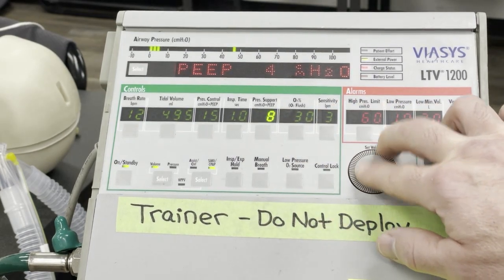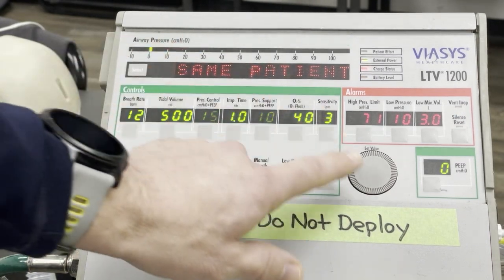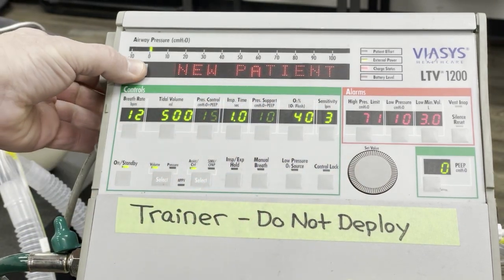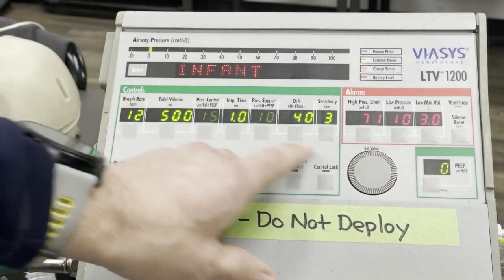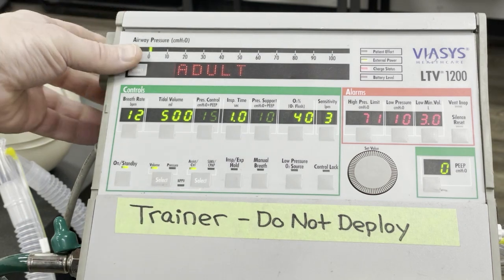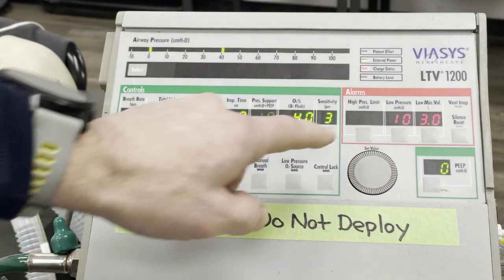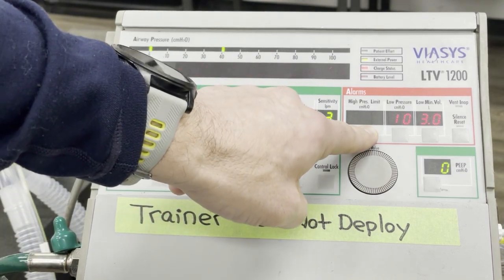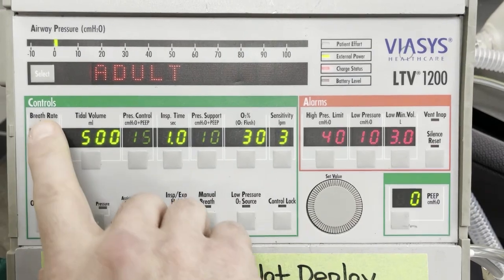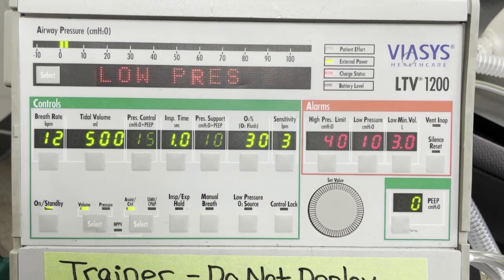Before you connect to your patient, power on the ventilator and program in the vent settings. Select new patient, then select patient category. As soon as you confirm patient category, the vent will begin to operate. Because it is not connected to the patient, the alarms will start almost immediately. This is expected and can be ignored for now. Be ready to push the silence reset button once to limit the distraction this noise causes.